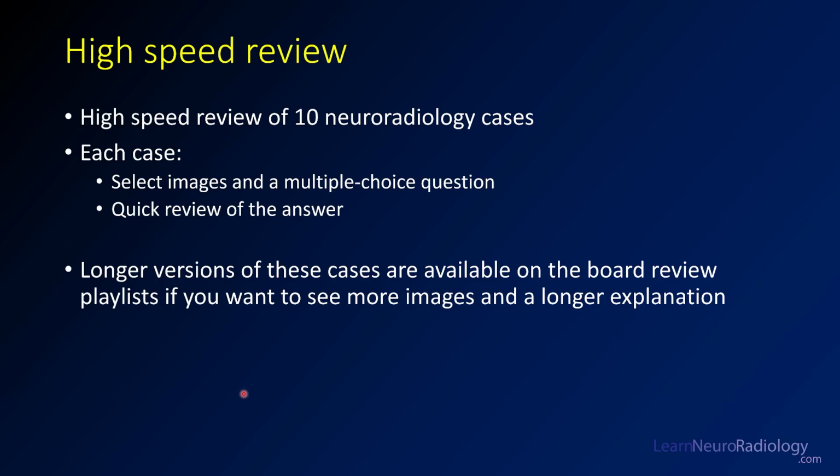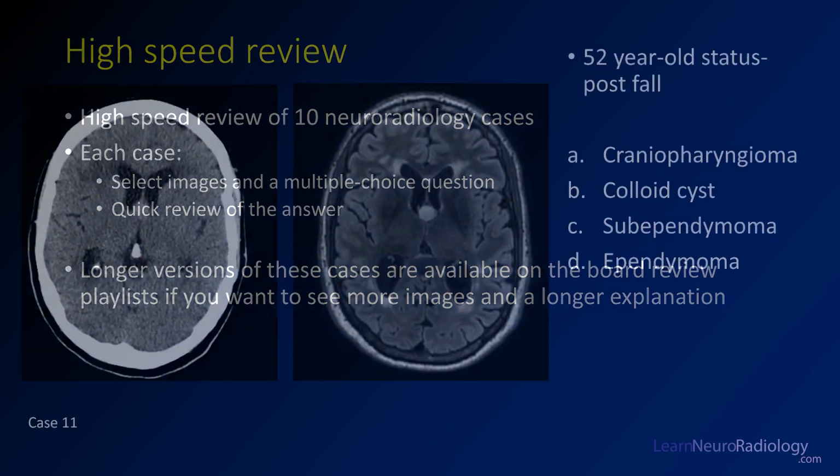Each case is going to have a multiple choice question. Then we'll take a quick review of the answer. If you want to see longer versions of these cases, there are longer versions in the board review playlist, so you can go back and check those out if you want. But this is really for quick hits, learn a few things, about 10 cases, about 10 minutes. So without further ado, let's go.